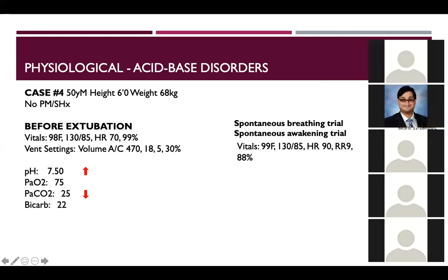So when Nancy, when you first gave the case, I thought maybe the respiratory rate was too high for him because it looked like he was just breathing out too much CO2. So I haven't done ICU yet, but I would maybe see how he does, and maybe he'll automatically raise his rate now on his own.